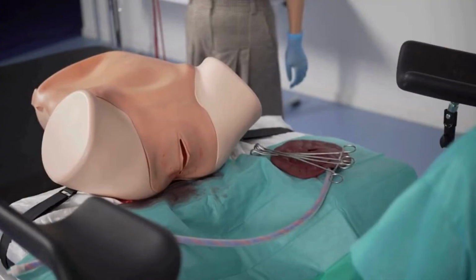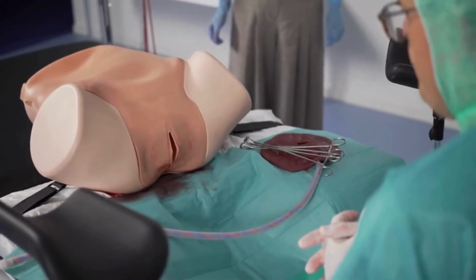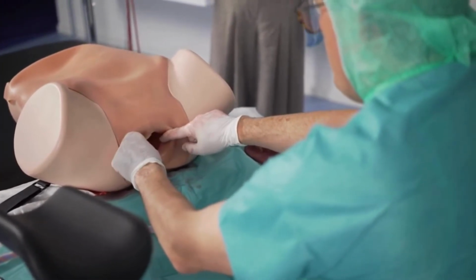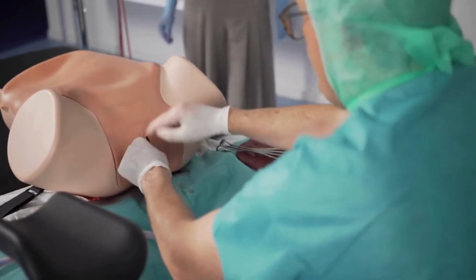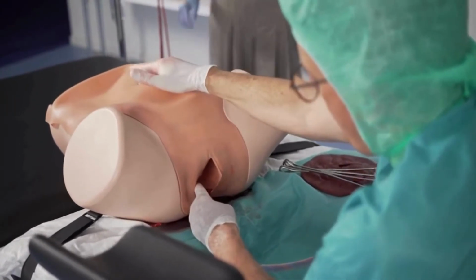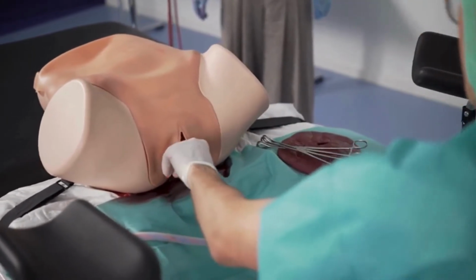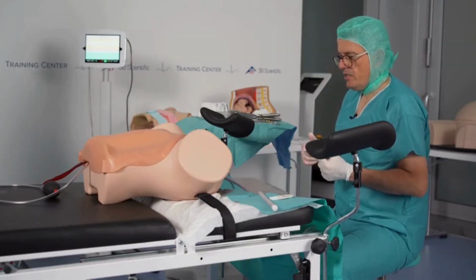After suturing that, we find that the patient is still bleeding from the uterus. Now you see that the patient is still bleeding from the uterine cavity. It takes a while until the blood is coming. Please switch it on. And we are very concerned because the uterus is getting softer and softer, and if you put pressure on the uterus, you can see that more and more blood is coming out of the uterus. And so we did a curettage, and the patient had Pitocin.